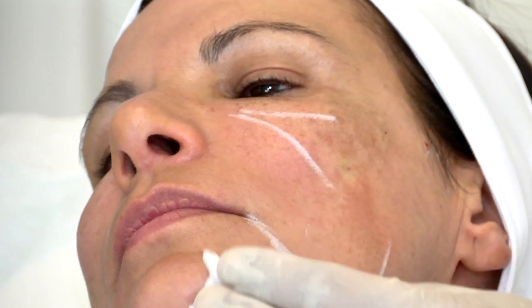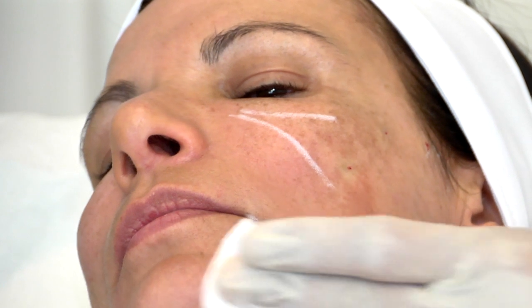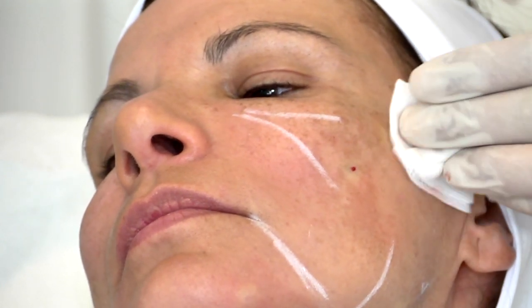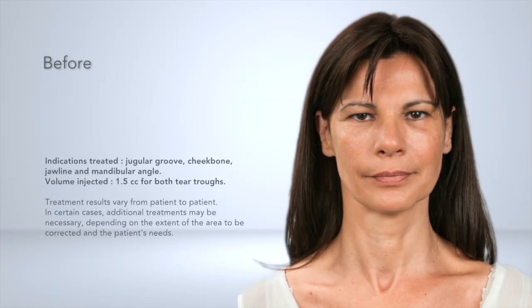The tear trough can also be injected using a needle by these same techniques or adjacent bolus techniques, the pillar technique, when volume loss requires greater projection.